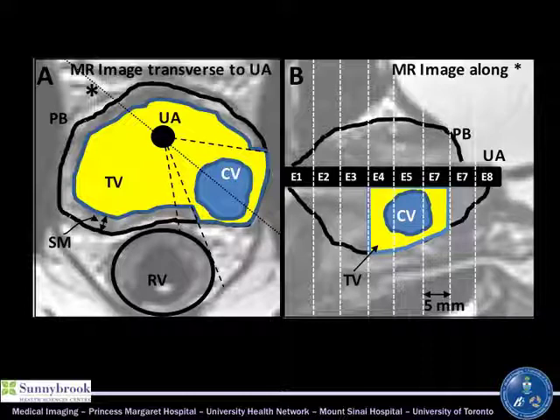So the idea of potential viable tissue in each gap as a weakness in the spot HIFU-based approaches is overcome with this. We still don't know whether we can reliably get right out to where a lot of the cancers sit, which is just deep to the capsule at the margin. I'm being very honest here. We're anxious to see whether we can do this.